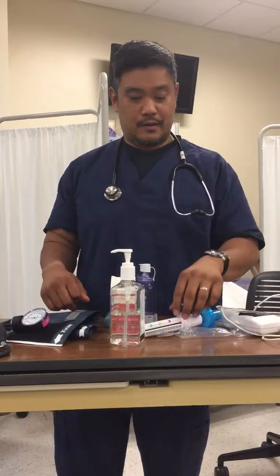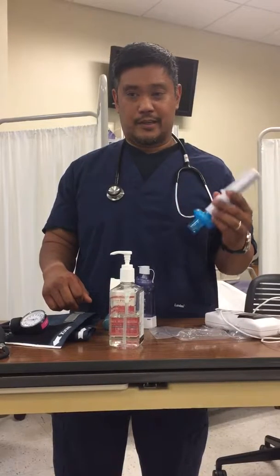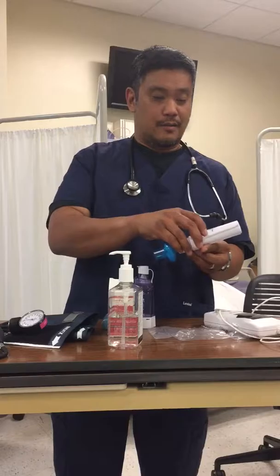For this device, we go ahead and do the post minus pre, divided by pre. We would be looking for a 15% increase, an improvement, to make sure the treatment has actually been beneficial. And I believe that's it. Thank you for listening.